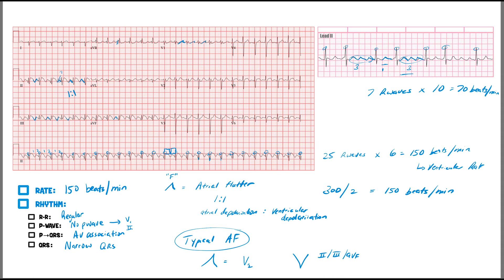This is typical atrial flutter — the most common type. In typical atrial flutter, the sawtooth waves in V1 are usually upright, and they point downward in leads 2, 3, and AVF. Here the waves point down in lead 2 and point up in V1 — that confirms typical atrial flutter. The most common ratio for atrial flutter is 2-to-1, meaning every two atrial depolarizations cause one ventricular depolarization.